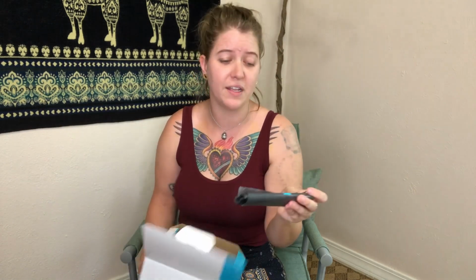All right, guys, I definitely recommend that you order a bulk supply of dog poop bags. The reason is that the amount of bags that come with your pouches, I think there's like five in here, is not a lot. It might even be less than that. Whenever you're changing your ostomy, it's really great to have a contained place to put all of your medical trash. When you're done, you just tie it up and throw it away, right? So I highly recommend these little bitty bags.